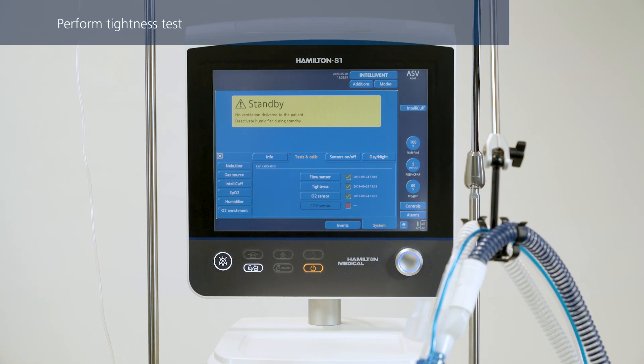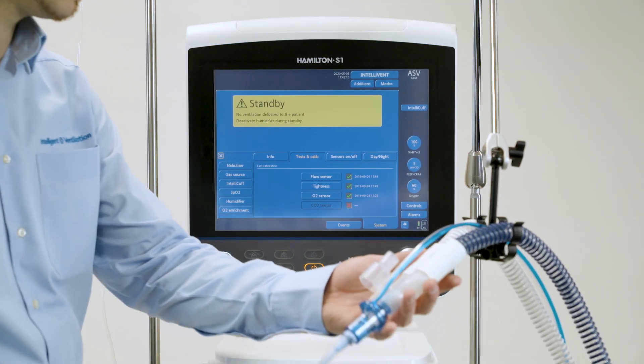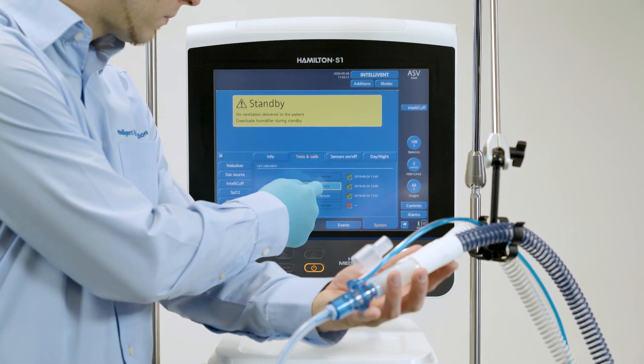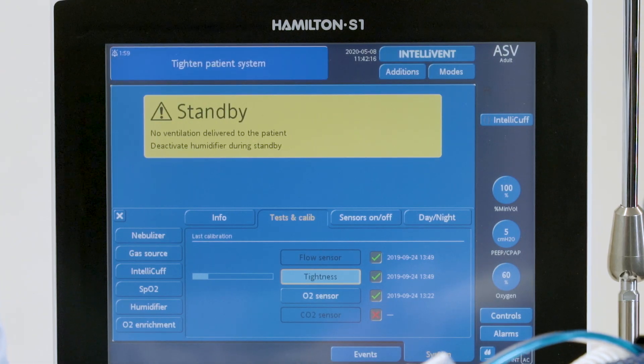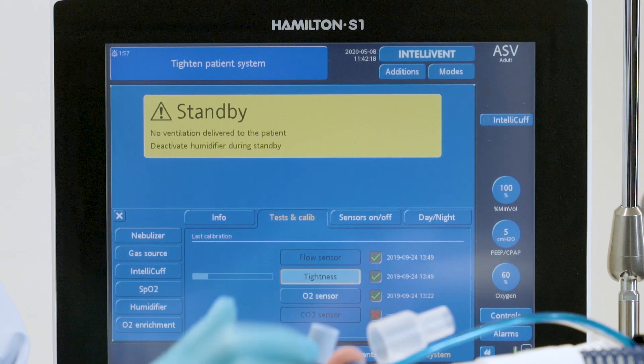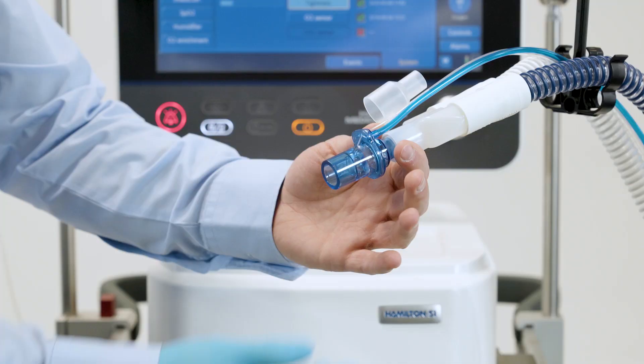The tightness test checks for leakage in the patient breathing circuit. To perform the tightness test, select the desired operation, then follow the instructions from the ventilator. Please note that wearing a glove is recommended. When the 'Disconnect patient' message appears, disconnect the test lung. When the message 'Tighten patient system' is displayed, block the opening.